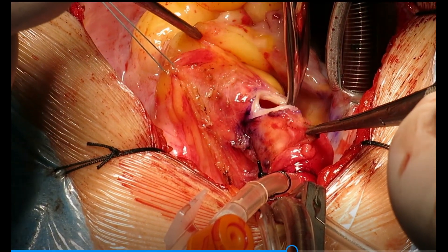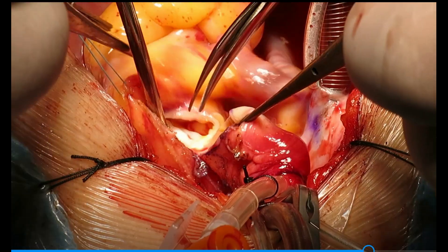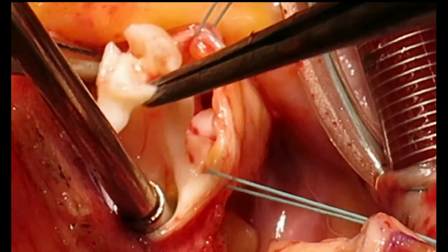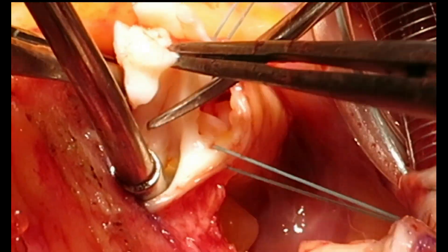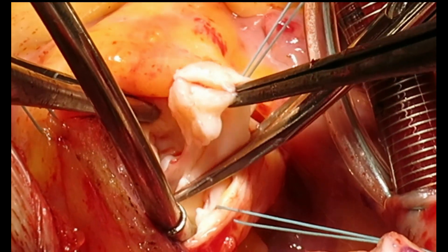After transecting the aorta just above the ST junction, we evaluate the severely myxomatous aortic valve. Finding it irreparable, we proceed with excision of the valve leaflets and then prepare the coronary buttons.